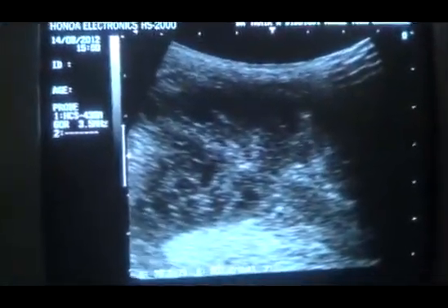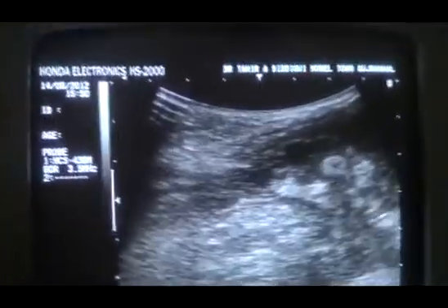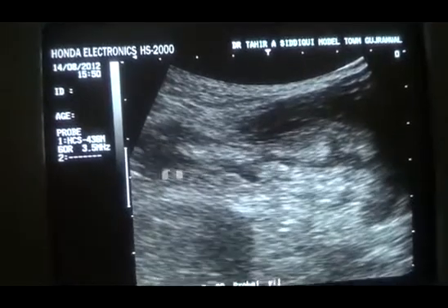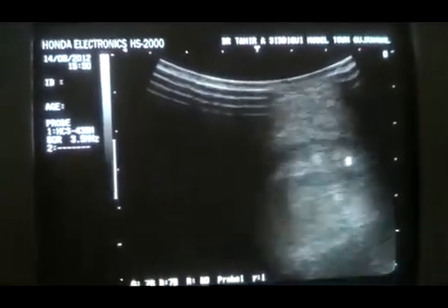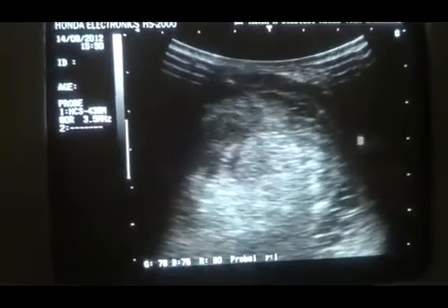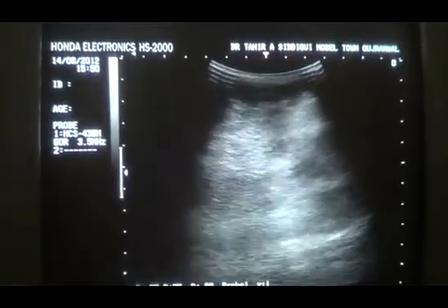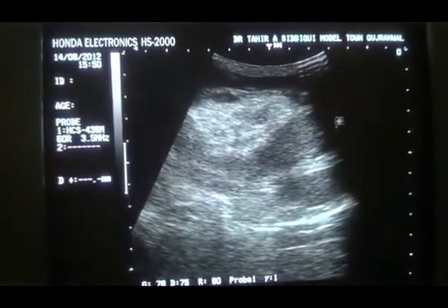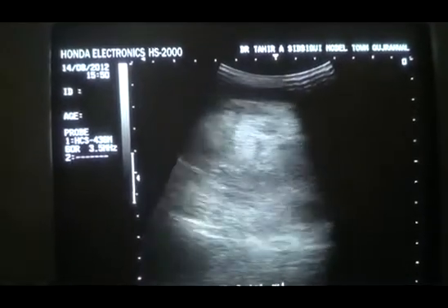So this is the story: there is a lot of fluid in this scrotal region, and there are bowel segments entering the left hemiscrotum. This is a bowel segment in long section, and this is a bowel segment in transverse section. They are entering the left hemiscrotum. So there is a scrotal hernia with bowel entering the left hemiscrotum. Thereby the left testis is pushed to the left scrotal wall.